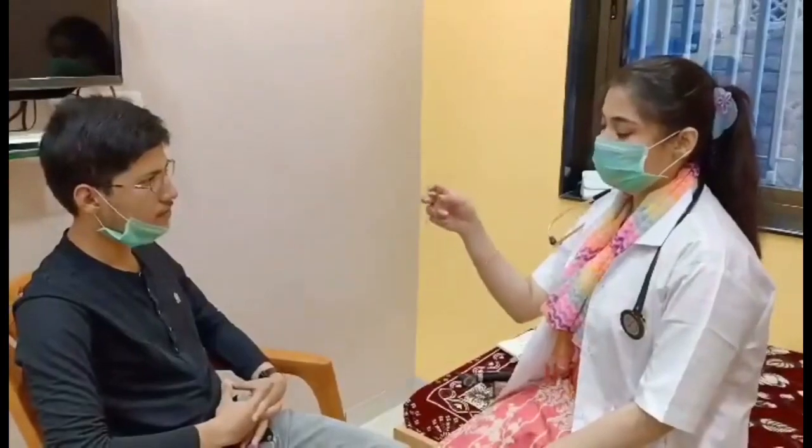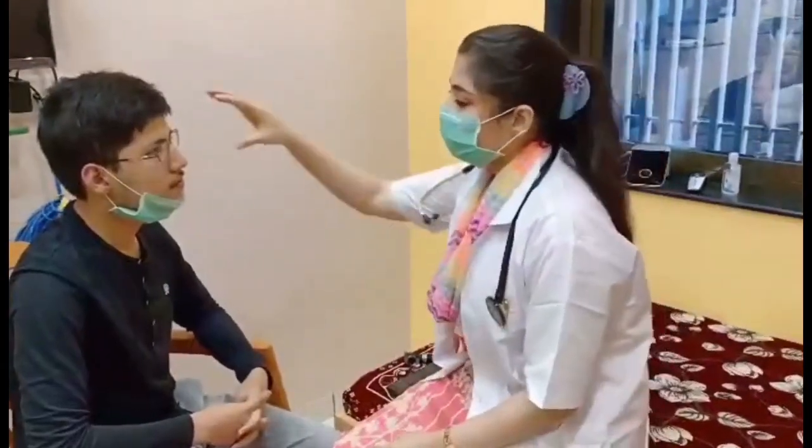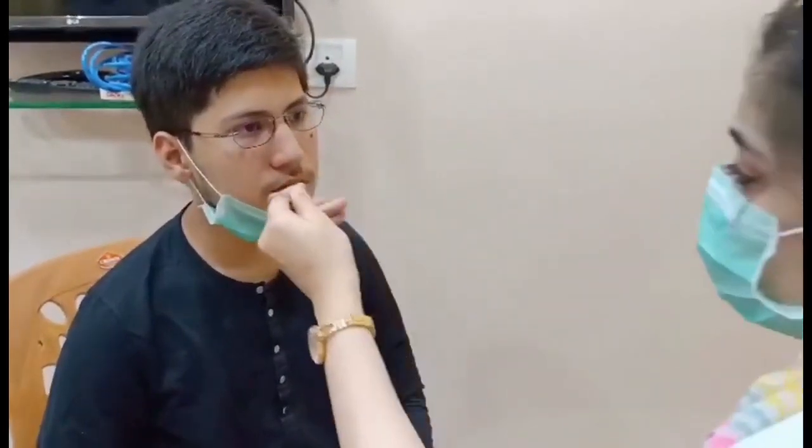We use the nasal speculum and we hold it like this with the help of the index finger. First, I'm going to check for any abnormality or any mass in the nasal cavity. Then I'll go for the anterior rhinoscopy. This is the nasal speculum. I'll introduce it in your nasal cavity.